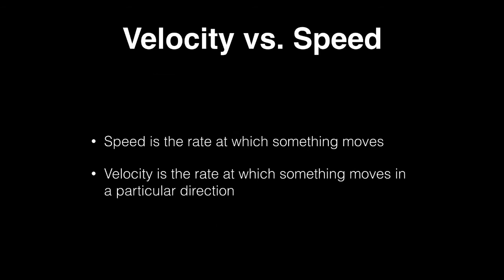What about velocity versus speed? We're mainly in Doppler ultrasound going to be talking about velocity. So whereas speed is the rate at which something moves, velocity is the rate at which something moves, but in a particular direction.